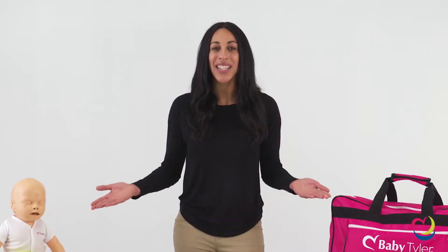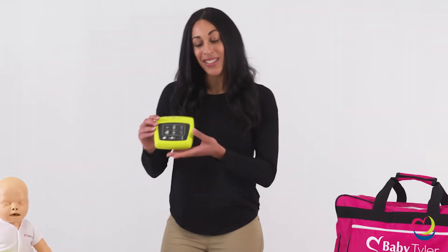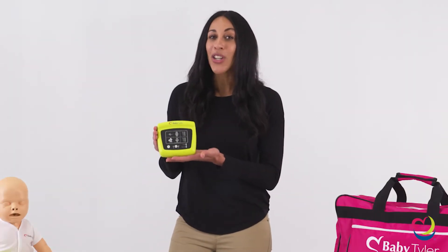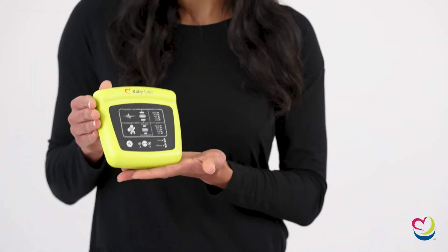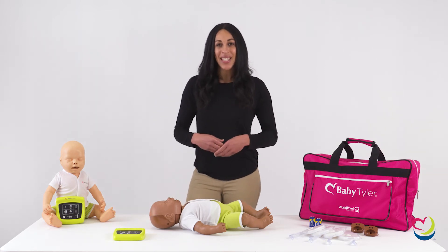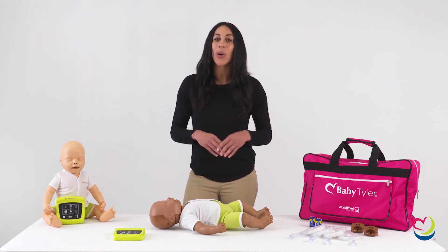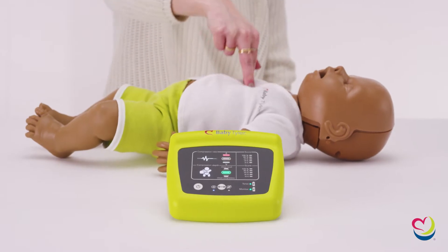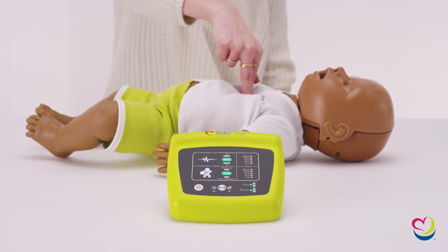Get 2020 American Heart Association guideline-compliant CPR feedback with WorldPoint products with Baby Tyler. The user-friendly wireless CPR monitor provides a modern training experience with none of the confusion or hassle of using a smartphone or tablet. Get CPR feedback on compression rate, compression depth, and chest recoil in real time. Or view training data in a post-training test report available 10 seconds after training.